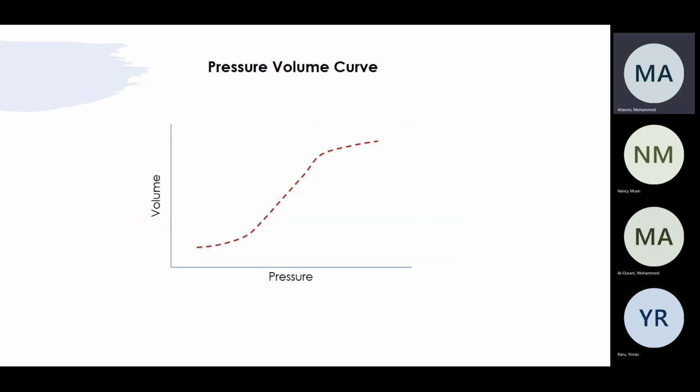All right, so why do we care about PEEP? From the video and everything, why don't we just not give PEEP? Because it has benefits and risks. Avoid barotrauma or atelectasis. If you have low PEEP, you get atelectasis, and if you have high PEEP, you risk barotrauma. Okay, and that can affect the patient's hemodynamics too.